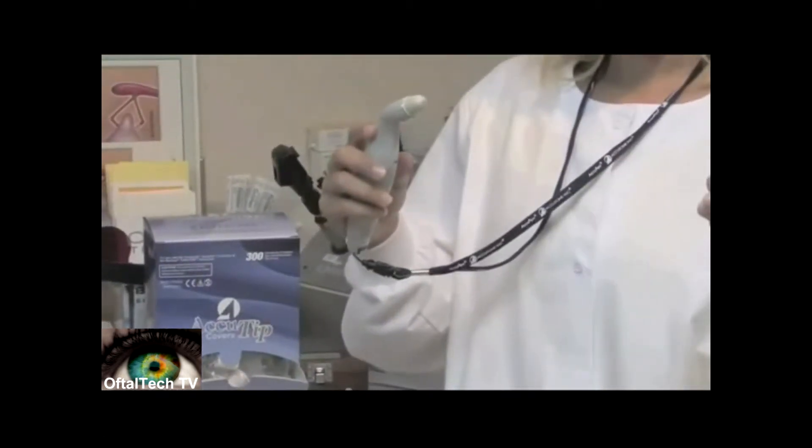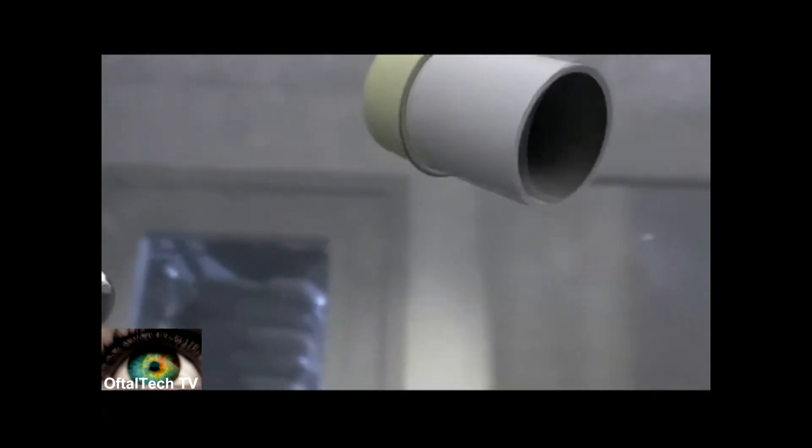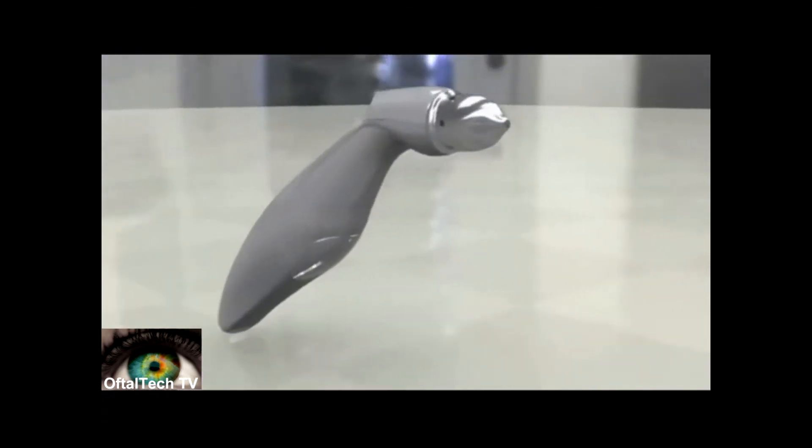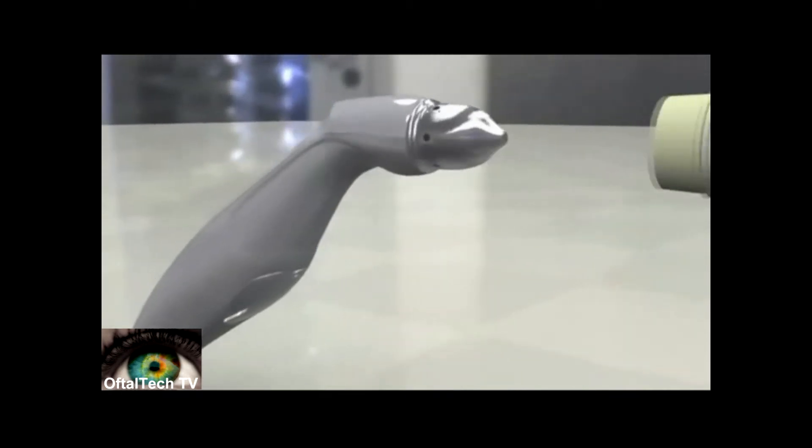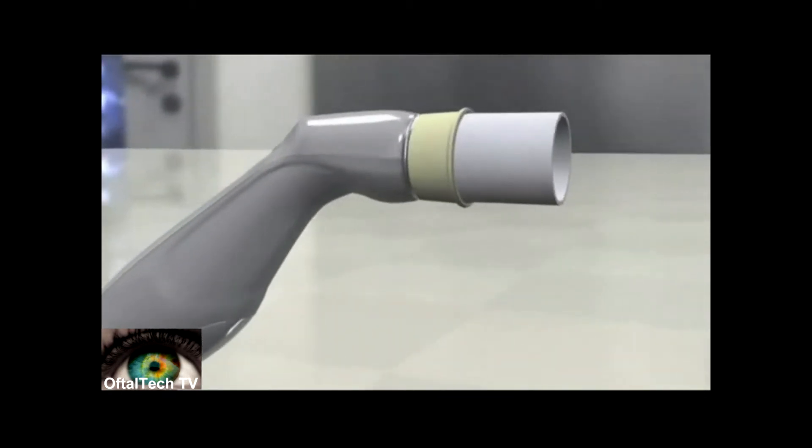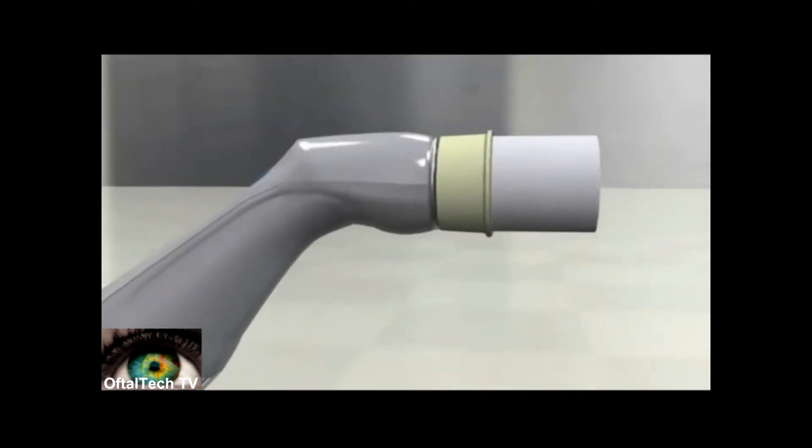AccuTip covers eliminate cross-contamination and protect the transducer tip from dust and liquids that could potentially damage the unit. AccuTip covers can be purchased directly from Accutone or authorized Accutone distributors.